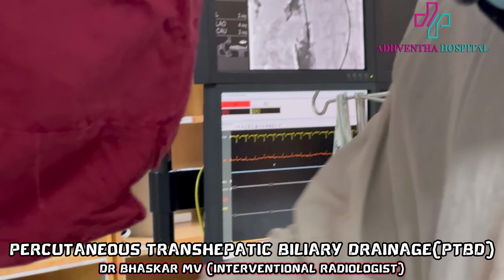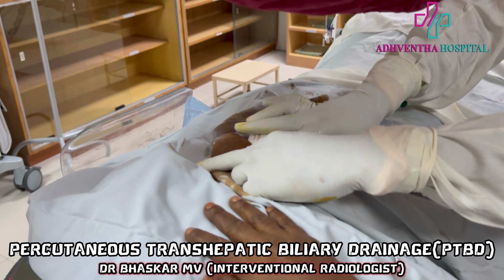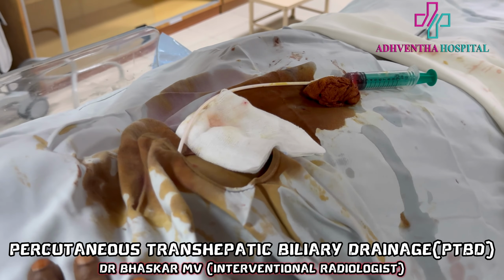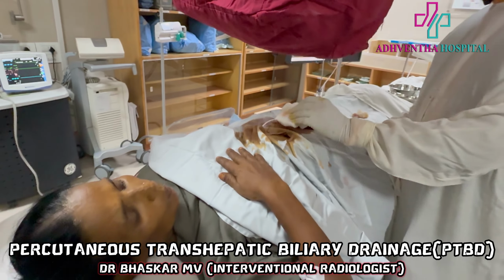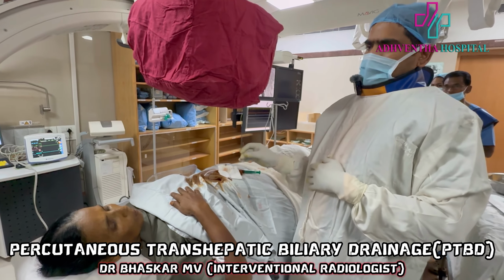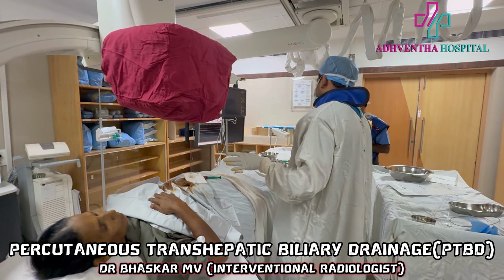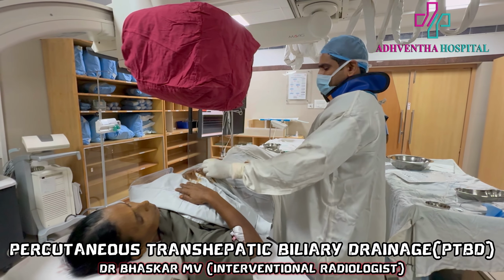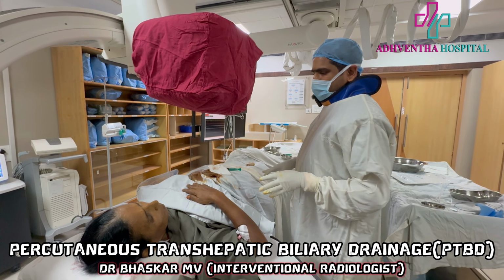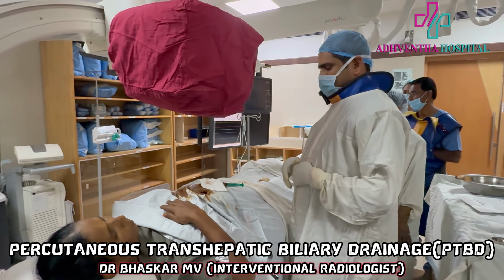You can appreciate here a small hole. It will not produce any scar. Amma, does it hurt? Patient also comfortable. That is a beautiful procedure, and it is done under local anesthesia, not even sedation. Patient is comfortable. Small tube is inserted, relieving the jaundice completely for the patient in just 2 days.